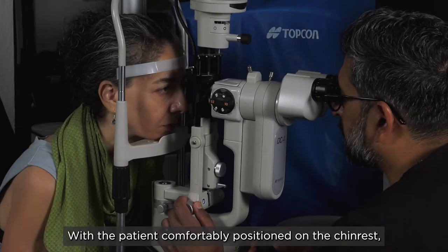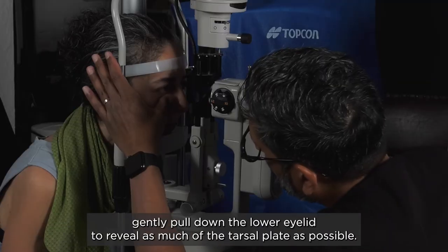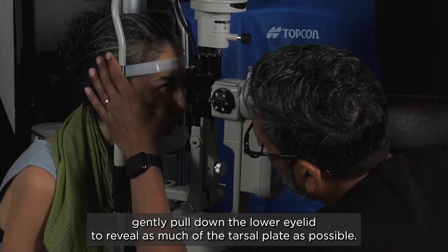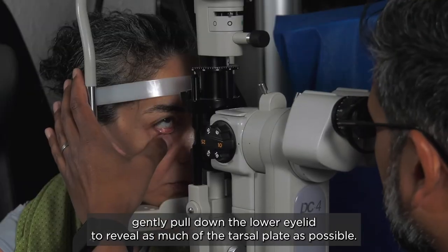With the patient comfortably positioned on the chin rest, gently pull down the lower eyelid to reveal as much of the tarsal plate as possible.